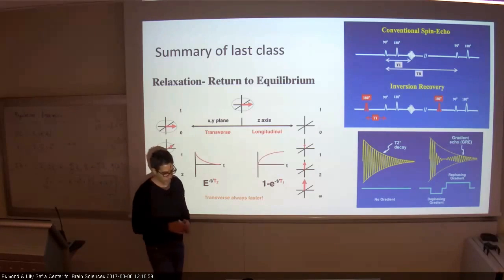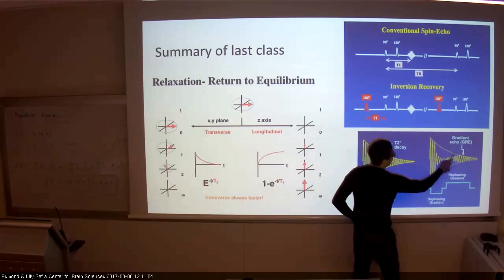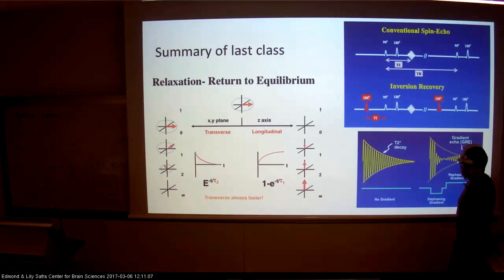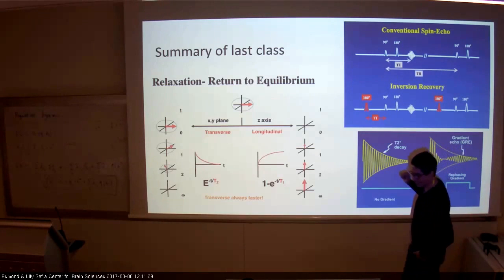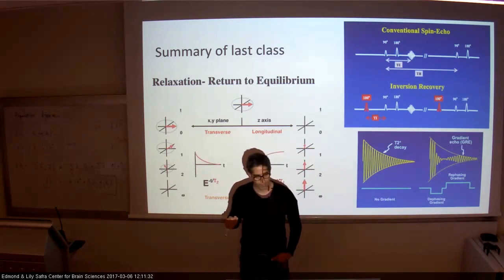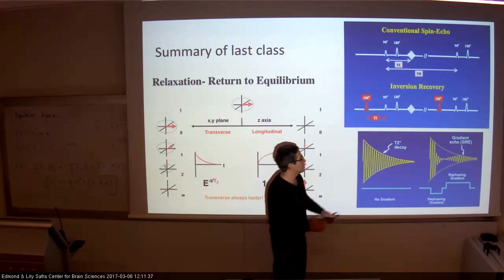And is that a T2 or T2 star? We said if we fit a line between here and here, that will be exactly a T2 star. The exponent that explains the difference between the peaks will be a T2 star. I just don't understand why it's better if they both give us a T2. This one's just going to be lost, and we won't have a signal. In here, we're going to get a signal sometime. We're going to get an echo. We need this echo for the measurements. Okay. So why would you use this one and not the free induction decay? No, I mean the one that we can put the inversion. Yeah, so see, this one was sensitive to T2 star.